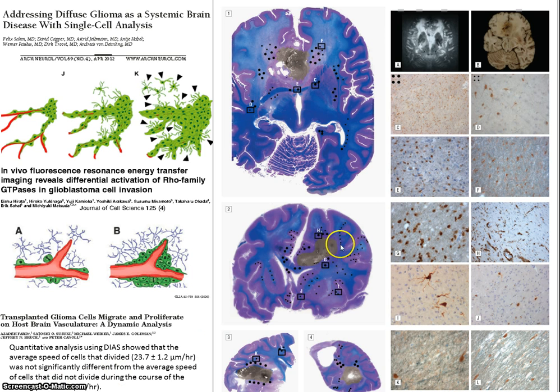So do all these spread through vasculature? Of course, I think since the 1940s, it's been claimed that it's both along the vasculature and within the myelinated tracts. So the challenge I'm going to place in front of you is, how do they actually do it? What's the environment that they're within? It's solid tissue, as you can see here. There's no empty space whatsoever. So how are they working their way through there?